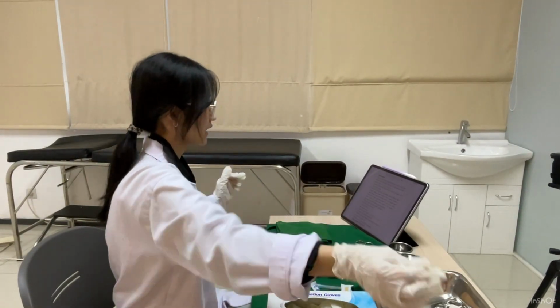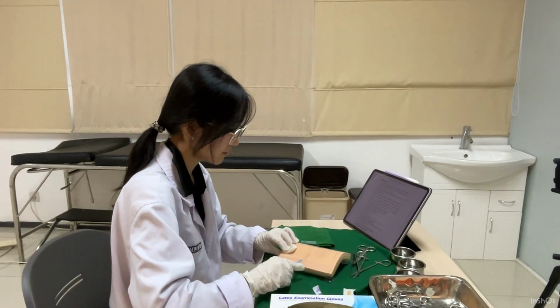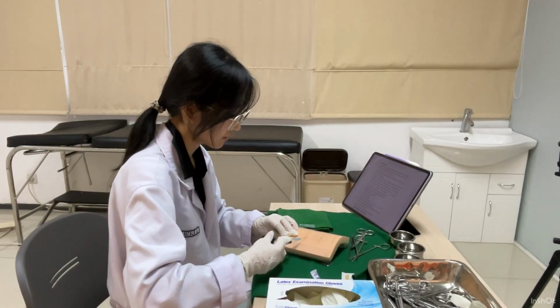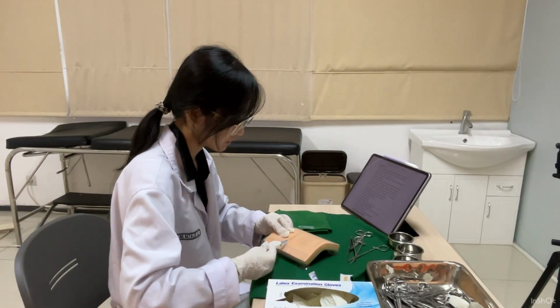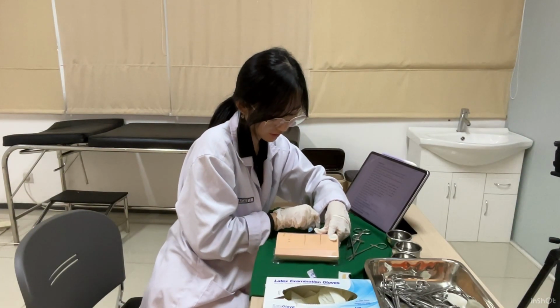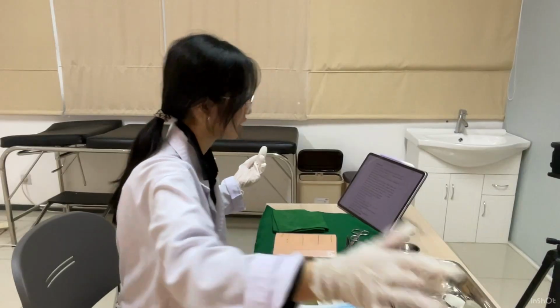Okay, so next after that I will perform local anesthesia. I will use the infiltration method. So excuse me. Now to the other side. Okay, so let it set in. And I will dispose the needle in the waste bin.